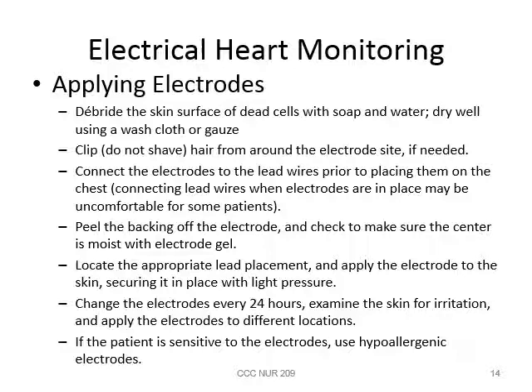Unfortunately, you do have patients that can be sensitive to the electrodes. There are special hypoallergenic electrodes. They're much more expensive, so do not use those unless you have to use them for a particular patient.